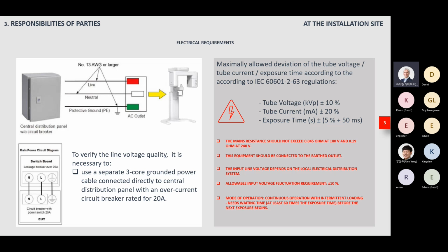So what the technical service engineer should know from this page is that you need to check, especially in most of the countries, some technical staff, the service engineers, forget to check this part during the installation.